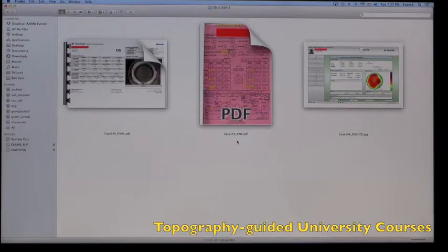There's a series of autorefraction keratometry, the autorefraction of the patient before drops, the glasses or contact lenses the patient is wearing, the dry refraction, a refraction after one drop of tropicamide, an autorefraction after that one drop of tropicamide in half an hour, and then a wavefront refraction where that was available. And then other data such as pupillometry, minimum cornea thickness, and what our clinical refraction of treatment would be in the boxes at the bottom.